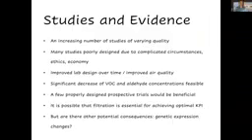So, a little bit about evidence. An increasing number of studies of varying quality has been published. Many studies have been poorly designed, for different reasons. There was ethics involved, because how can you really do a study? You have to have two parallel labs, probably far apart inside one building or in two buildings next to each other. Then you would have different staffing. The economy would be incredible. So usually these studies have been serial.